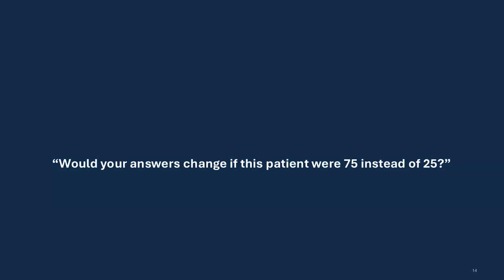Sir, I have a question because I received a call that interrupted the lecture. Why is the paced rhythm right bundle? Maybe it is left bundle area pacing? Okay. Left bundle area pacing will make a right bundle pattern like this. Okay. And maybe this. Yeah. Okay. We can continue. Yes.